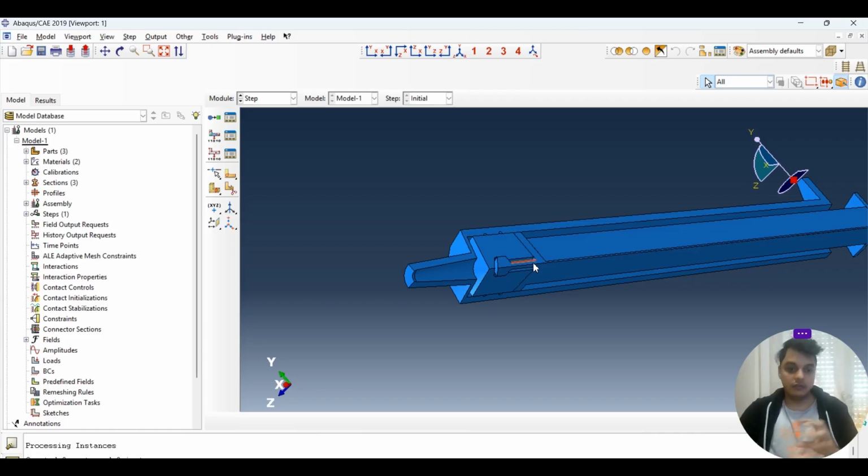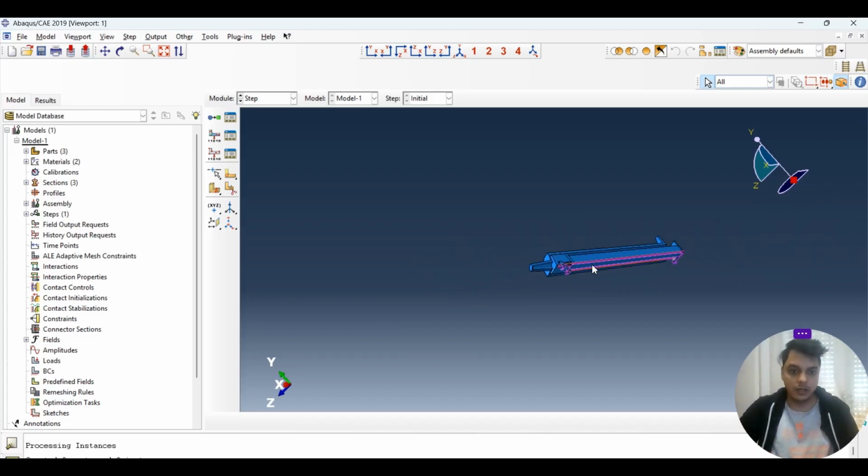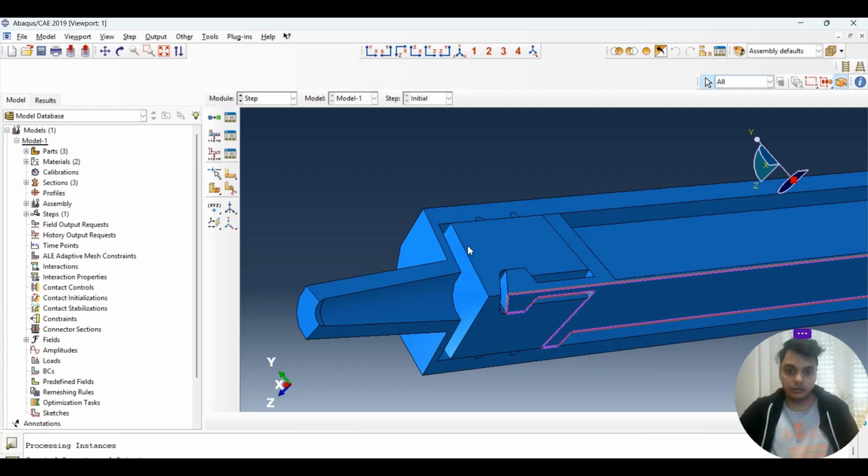And after that, we have to change the friction, so that we involve the friction while pushing, and then we have to apply a plunger displacement, or the so-called force in general. So you can apply a load in 2 terms. One is the load, applying the force, or applying the displacement. In this case, we will apply the displacement in general. I hope you guys have understood how exactly the steps are defined.